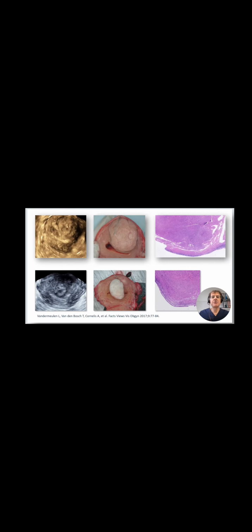Ten years ago, we published a paper, the MUSA paper, about the terms and definitions of how to define uterine masses. In this paper we tried to see what the ultrasound features were of the myometrium, for instance, of fibroids. Later we also tried to correlate these ultrasound features with microscopy.